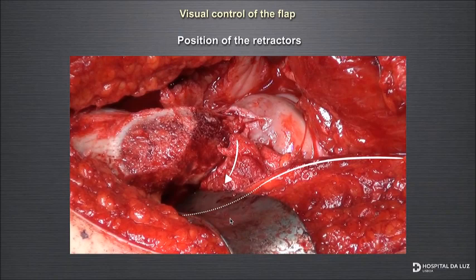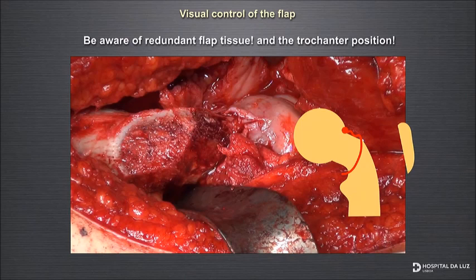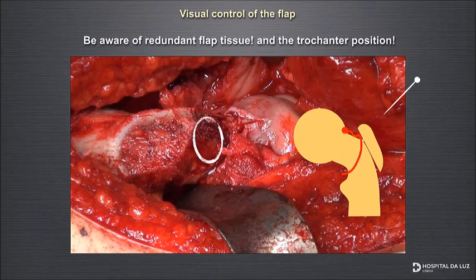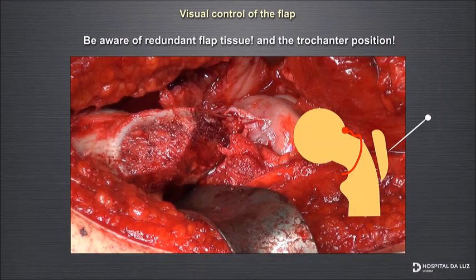Another tip when fixing the trochanter: you must fix the distal screw first, because if you fix the more proximal screw first, you can compress the vessels — especially when they are redundant — and kill the circulation to the femoral head. By placing the distal screw first, you are actively protecting the circulation. Normally I place it more distally in this location.